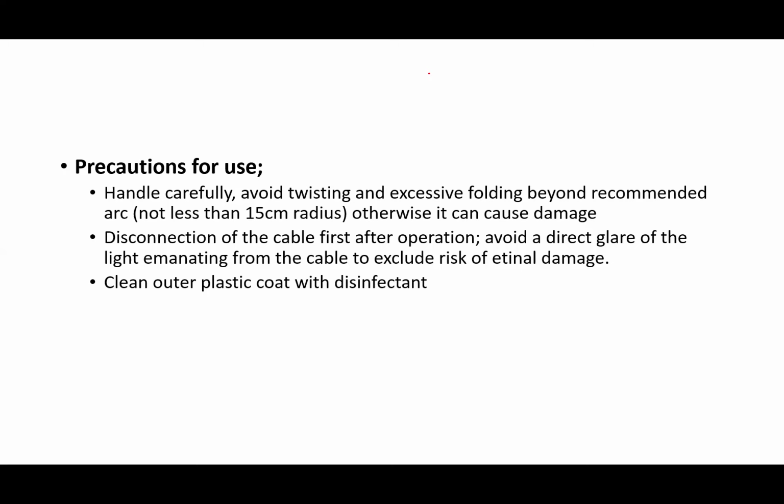Now, you should disconnect the cable first after operation. You don't just remove the telescope and shine light in people's eyes. So avoid direct glare of the light emanating from the cable, okay, to exclude risks of retinal damage.